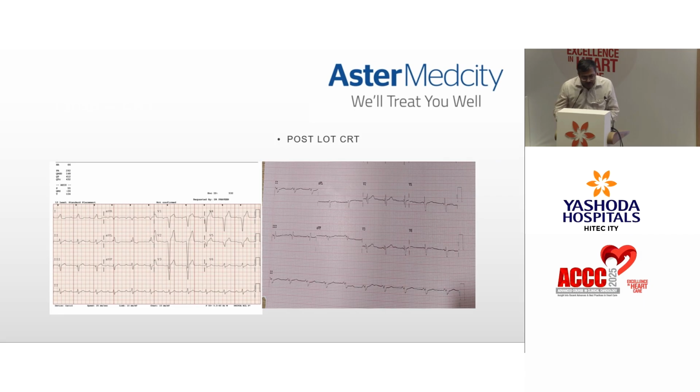LOT is a concept where you put a CRT and additionally you put a left bundle pacing lead and connect it to the pace sense port of the CRT. So you have 4 wires. The sensing happens from the left bundle pacing catheter and additionally you have a conventional epicardial coronary sinus lead. So you are truly synchronizing the left ventricle from either side, from the septal side and from the epicardial side.